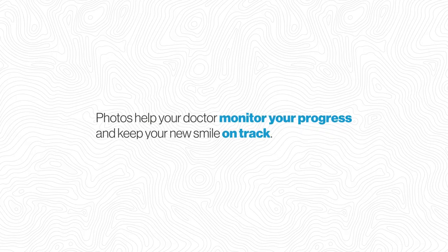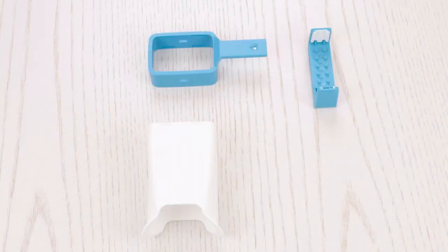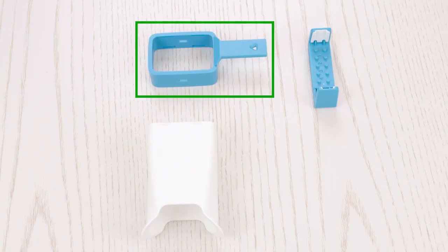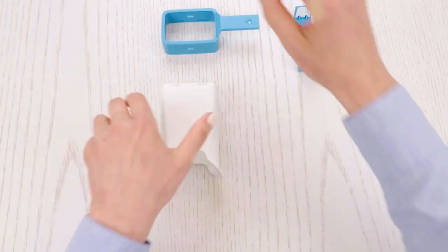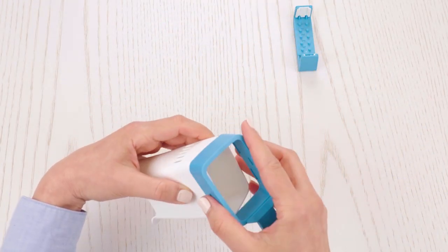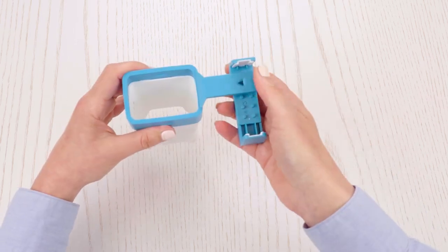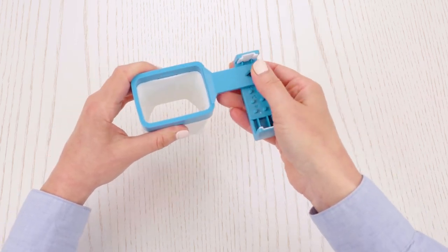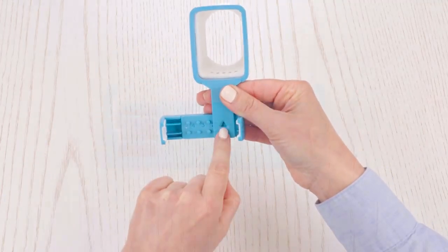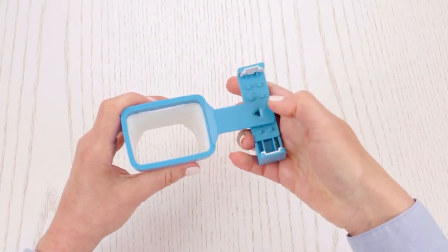Next, we will assemble the Invisalign lens, which consists of 3 parts: the photo lens, the frame, and a slider. Step 1. Connect the frame to the lens and snap it in place. Step 2. Connect the frame to the slider. Please note that cameras in the upper left corner of the phone start at the 1 position on the slider. Be sure to change the slider position to accommodate your phone's camera.